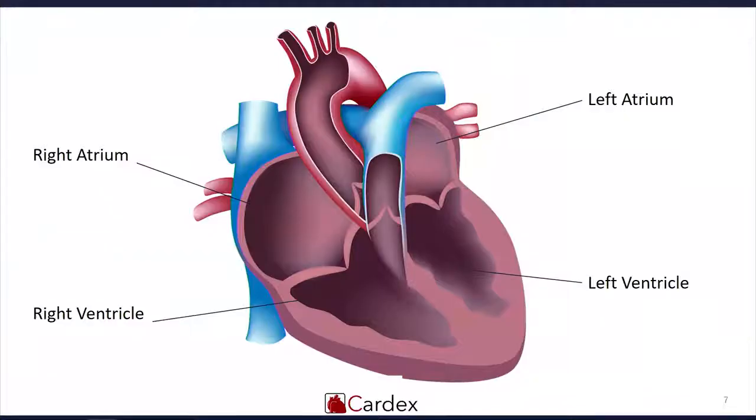Now, to further understand the underlying difficulties, let's have a closer look at the human heart, with the right atrium and ventricle and the left atrium and ventricle. Access to the right side can be easily established, as shown before, but direct access to the left side is complicated due to twists and hooks in the blood vessels. Therefore, one uses the Transseptal Puncture procedure to make a tunnel into the wall separating the atria. The wall is punctured at a particularly weak spot called the fossa ovalis.